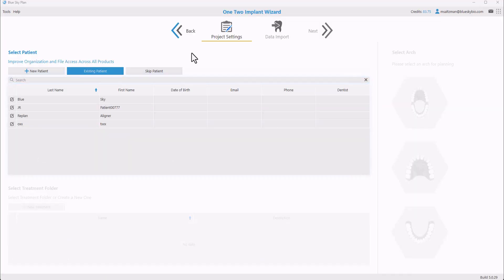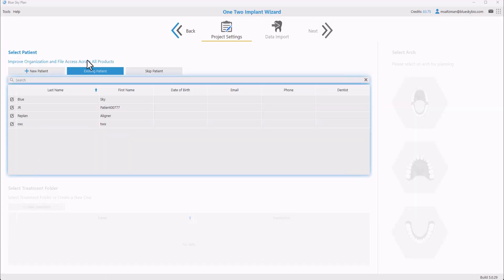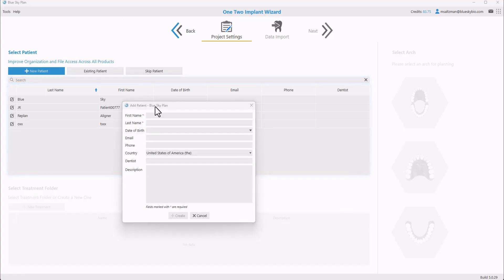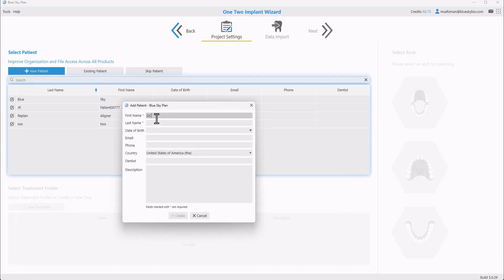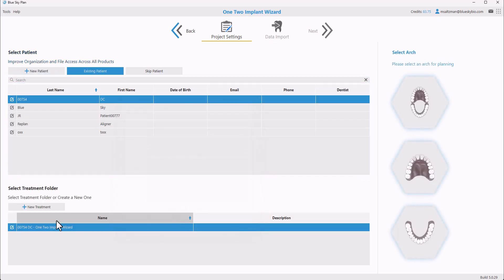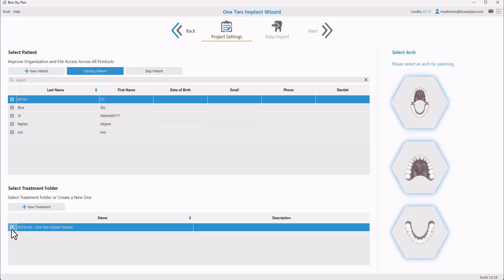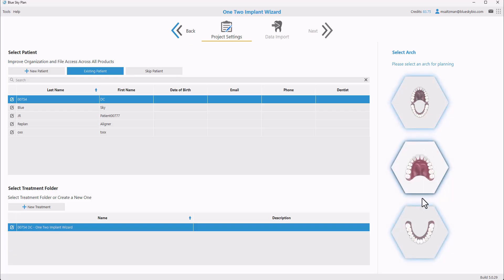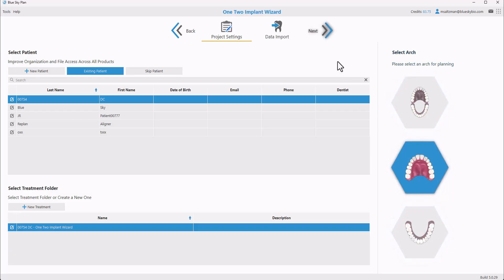We're going to associate this case with our patient for organized patient data. We're going to enter a unique patient identifier and then click the Create button. Our treatment is automatically created for us, and we could review and edit if necessary.